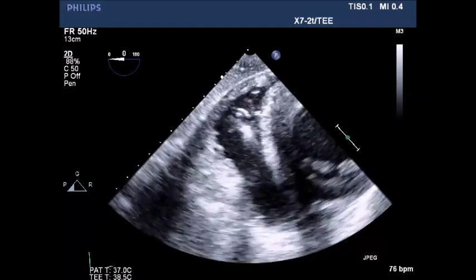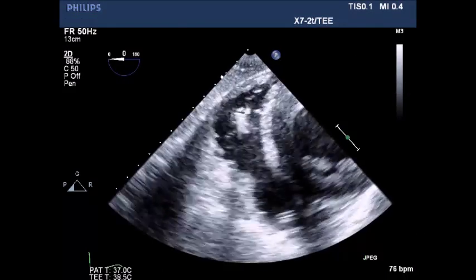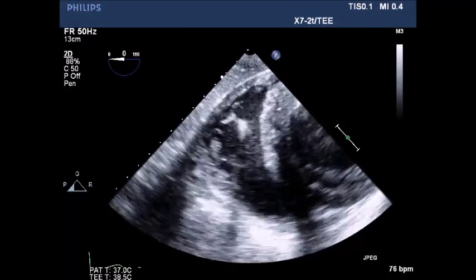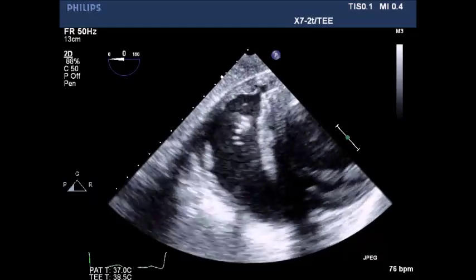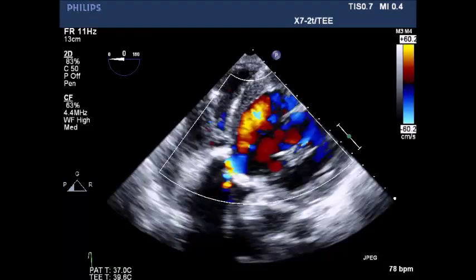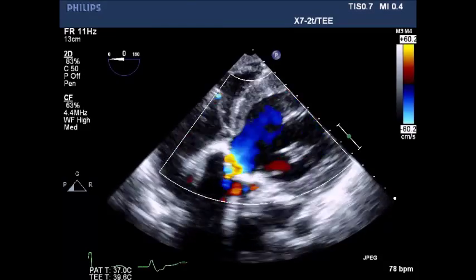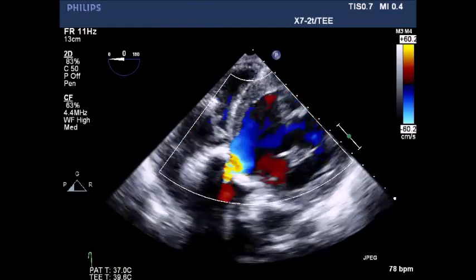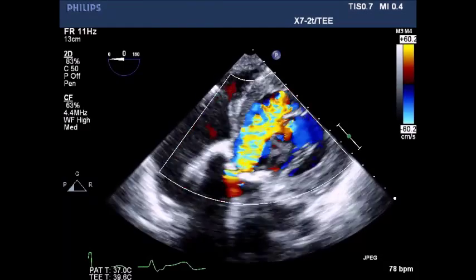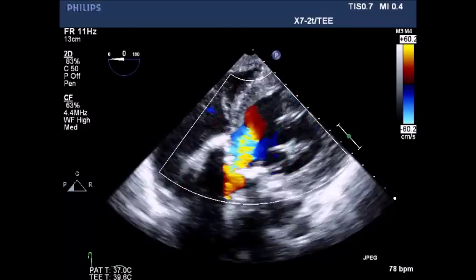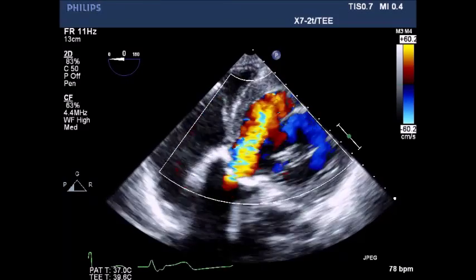Transgastric view of the RV with overall normal contractility. Deep transgastric view with color flow Doppler showing a motionless aortic valve and severe aortic insufficiency.